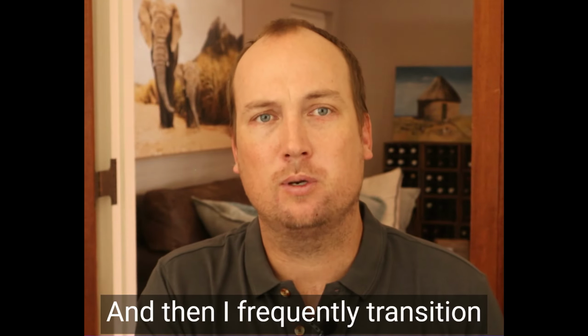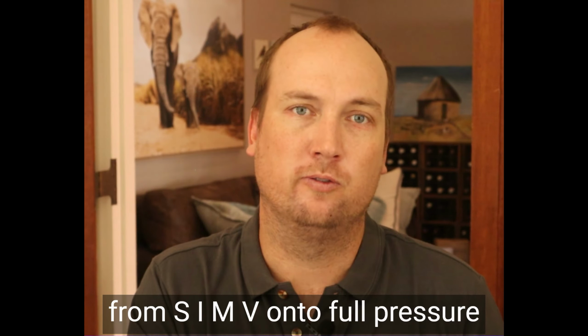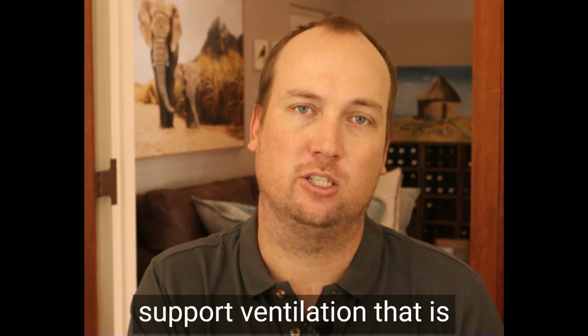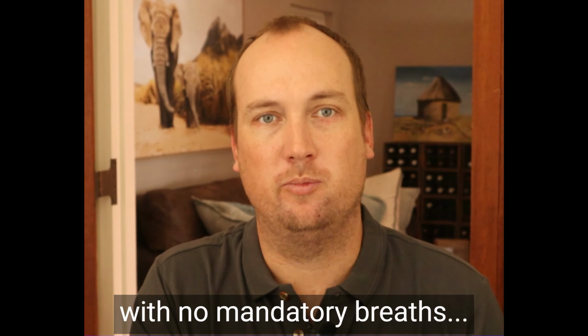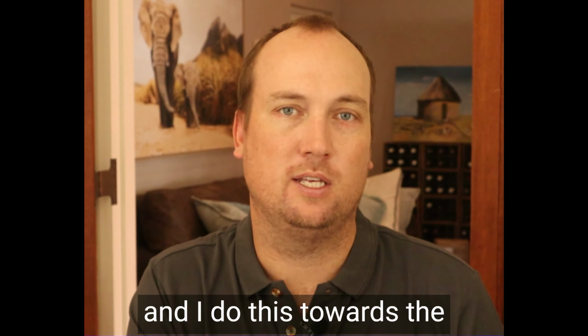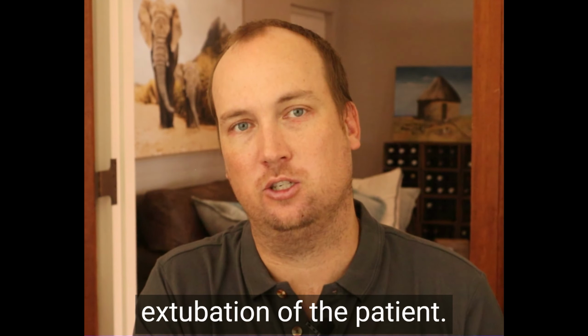And then I frequently transition from SIMV onto full pressure support ventilation. That is spontaneous breaths that are supported by the ventilator with no mandatory breaths. And I do this towards the end of the surgery, during emergence, and just prior to extubation of the patient.